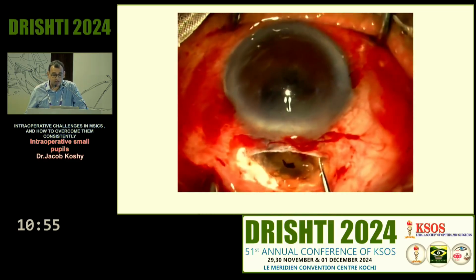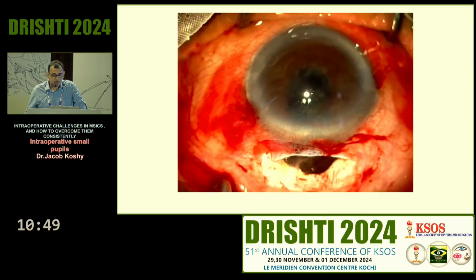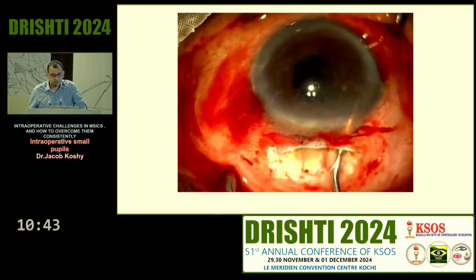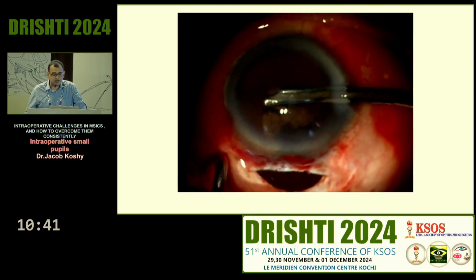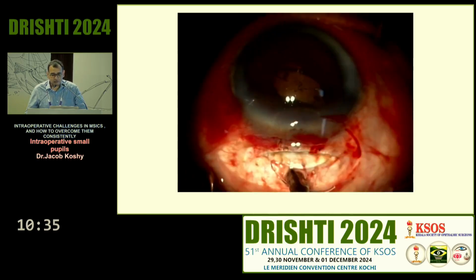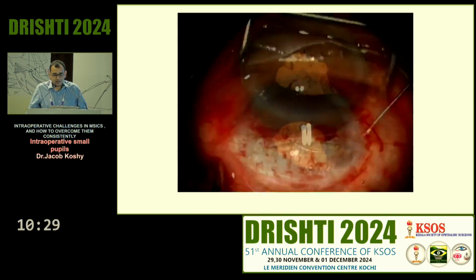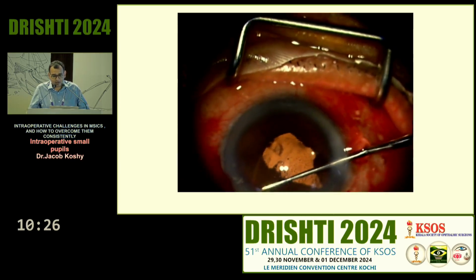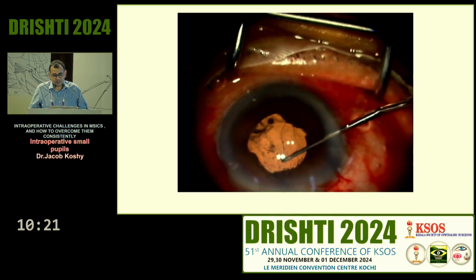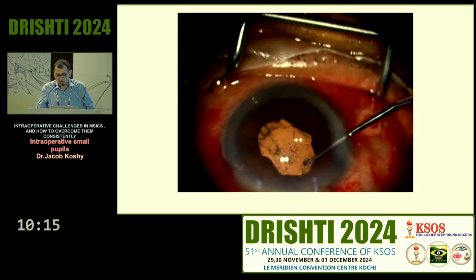Thankfully, this was not a very hard lens, and I was able to get the lens out, and then you reposit the iris. You can do that with any iris repositor, and then gently start doing the IA. As soon as you start the IA, again you have iris prolapse, leave it alone, don't keep handling it, try and use the side port. And yeah, so here we have a PMMA lens going in. Thankfully, even though all the complications were coming, I did not have a vitreous prolapse or any rent or anything, and managed to put the lens into the bag. Remember to suture these wounds. You have to suture these wounds before you get out.